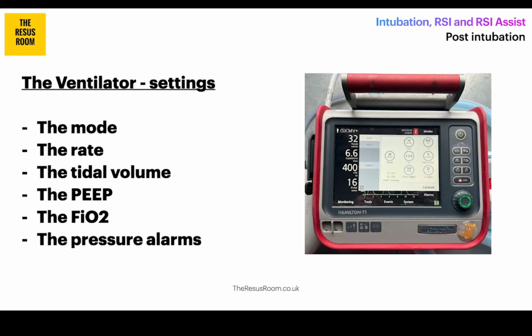Now the FiO2, or the fraction of inspired oxygen, well, this setting will depend on a couple of factors. Firstly, the ventilator you have might determine what you can give, so some older models have 100%, 50% or nothing. Others allow you to set the exact amount depending on your patient needs.